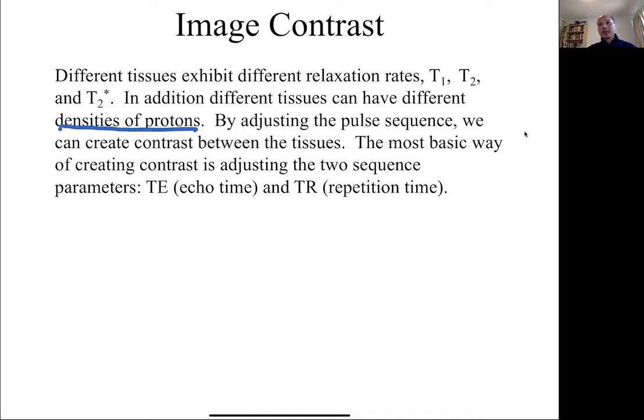How do we take advantage of that image contrast? We'll see that the two main ways of creating contrast that we'll talk about today are by adjusting the echo time and the repetition time.